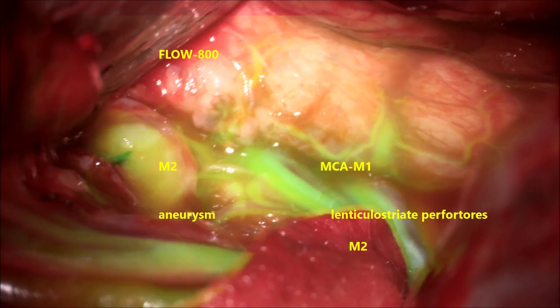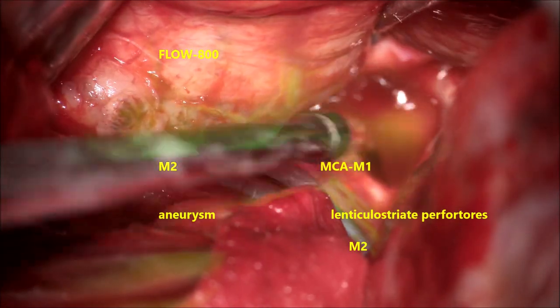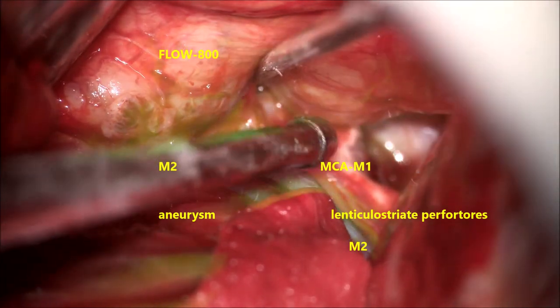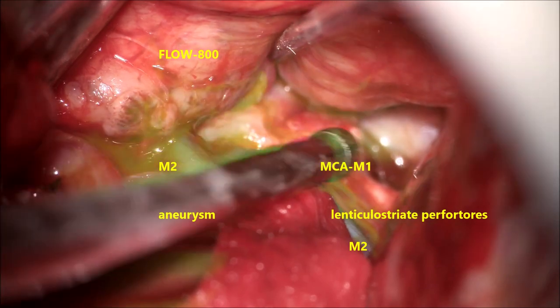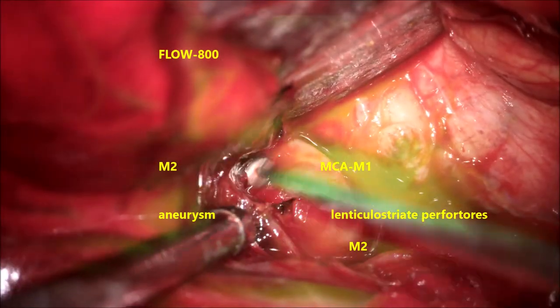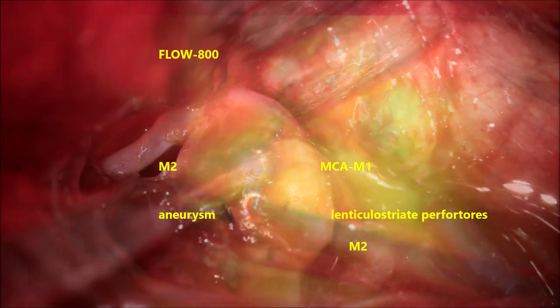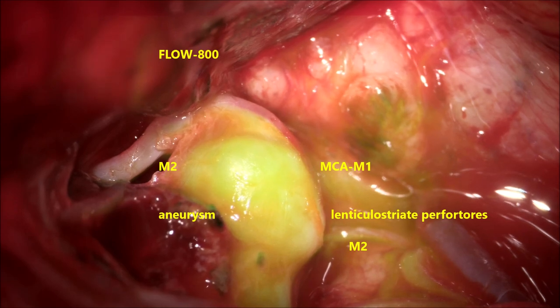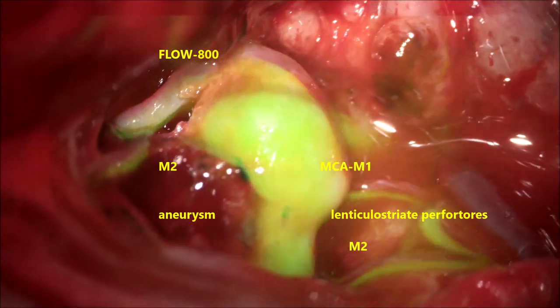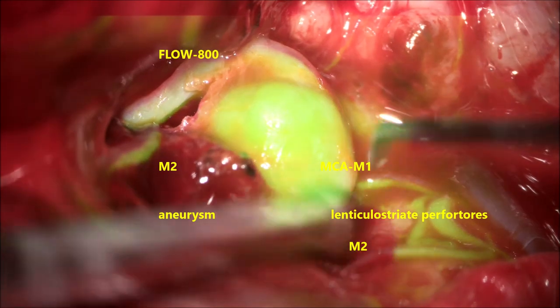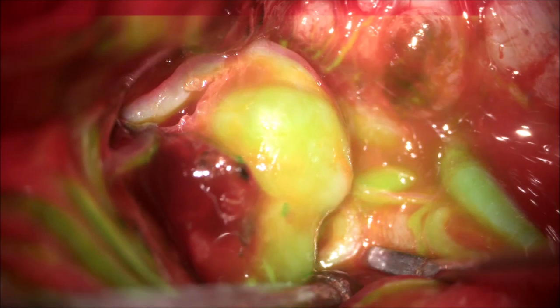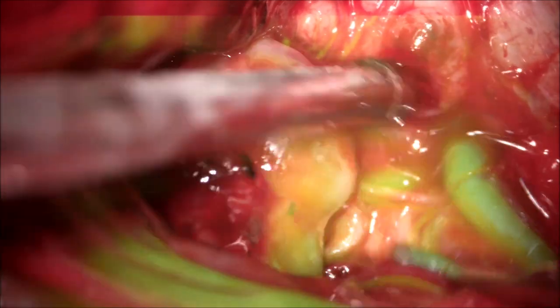The Flow 800 ICG confirms the lenticulostriate arteries originating from M1. The M1 is identified, and distally the veins and arteries in the Sylvian fissure are visible. The dome of the aneurysm is clearly seen. ICG with Flow 800 nicely and clearly demonstrates the anterior M2 division, the posterior M2 division, and the aneurysm dome.